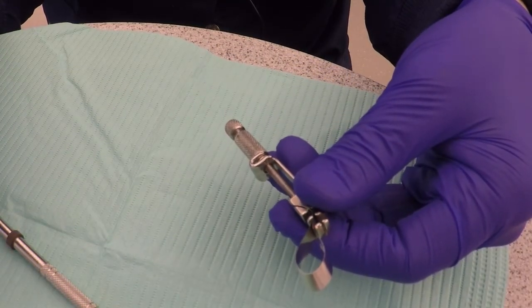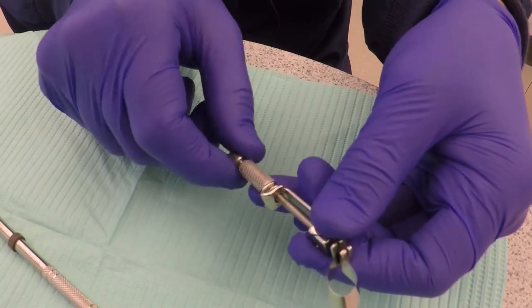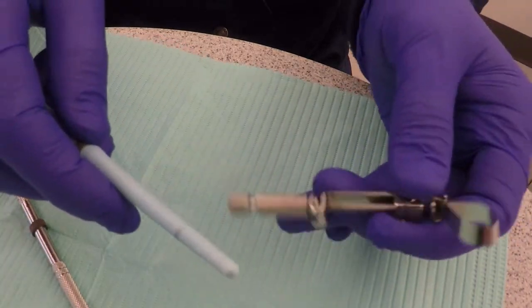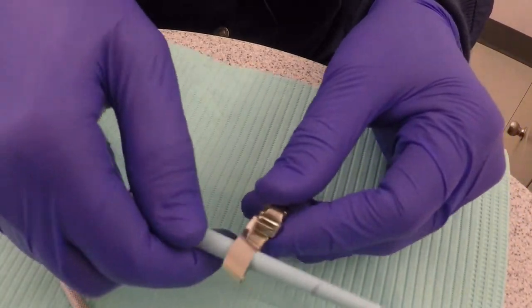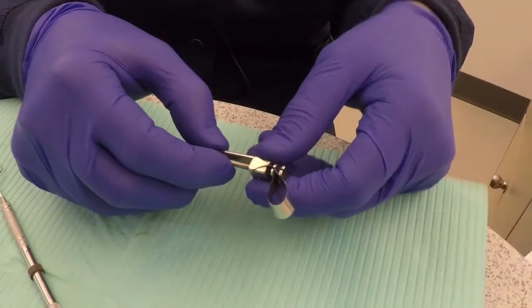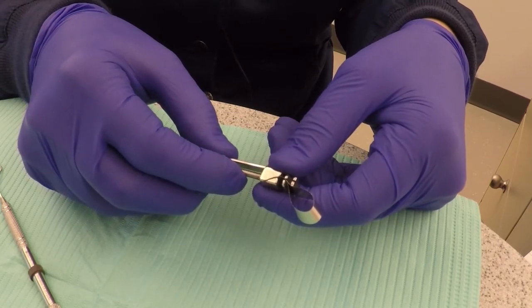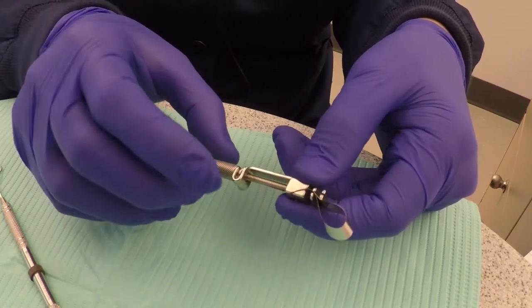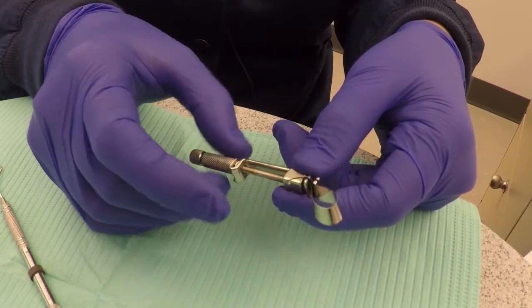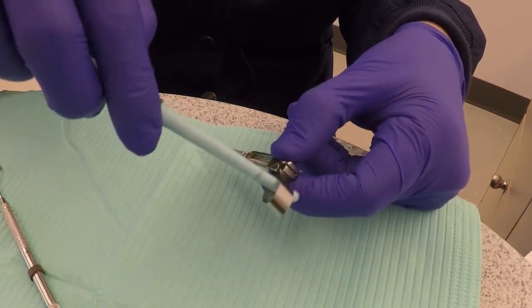Check that the band is correctly placed inside the retainer and then secure the band by turning the outer knob clockwise. Once the band is secure, you can use the handle of a mouth mirror to open and round the loop of the band. Adjust the size of the loop to fit the selected tooth using the inner larger knob — the loop should be slightly larger than the tooth being restored, so turn the inner knob counter-clockwise to give more room to go around the molar.